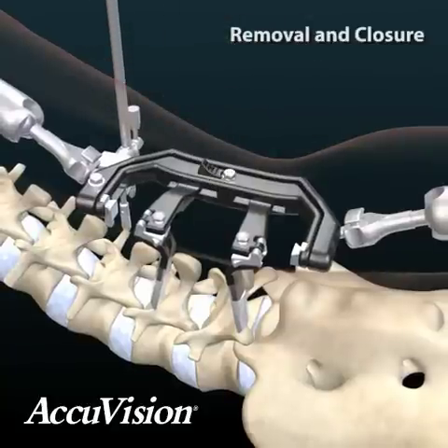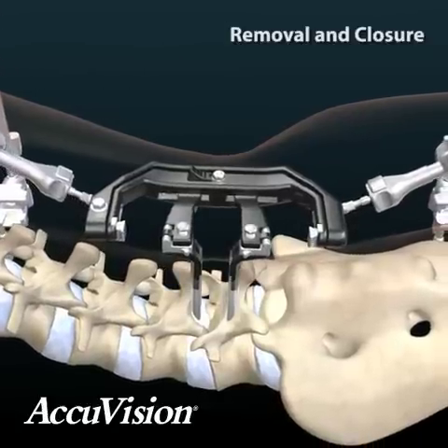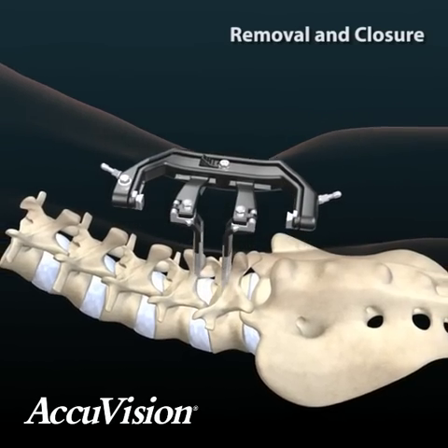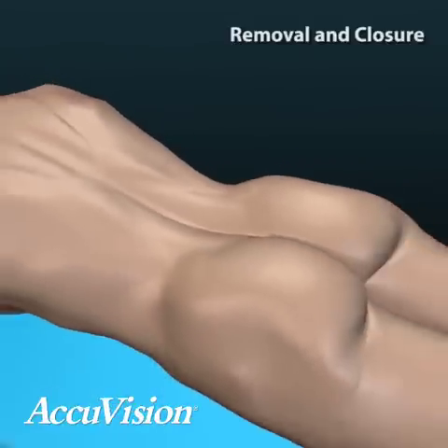Cephalad caudal distraction is reduced, and any distal angulation of the individual blades is reduced. The articulating arms are unlocked at the field post and removed from the posts of the retractor frame. The frame is removed from the surgical site, and closure of the wound is performed according to the standard of care.